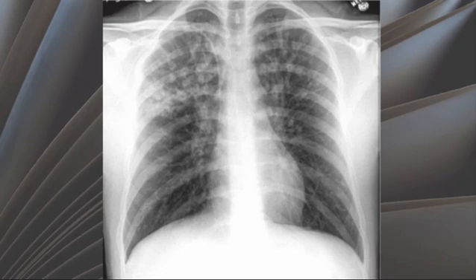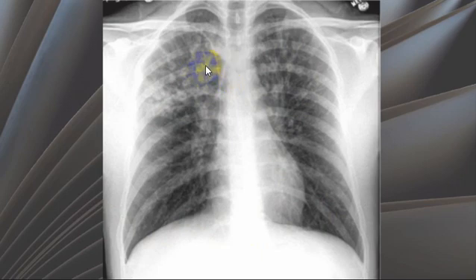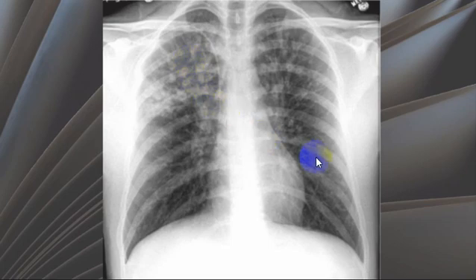As we see here in this PA view of a patient, the lungs are hyperinflated and multiple ring shadows noted on both upper lobes, more to the right side, with some loss of volume on the right side. Some of the ring shadows have a branching pattern due to mucous plug impaction, giving the appearance of finger-in-glove appearance.